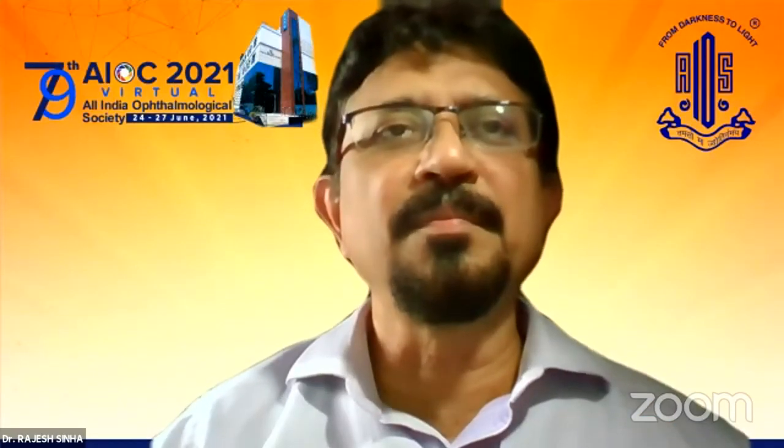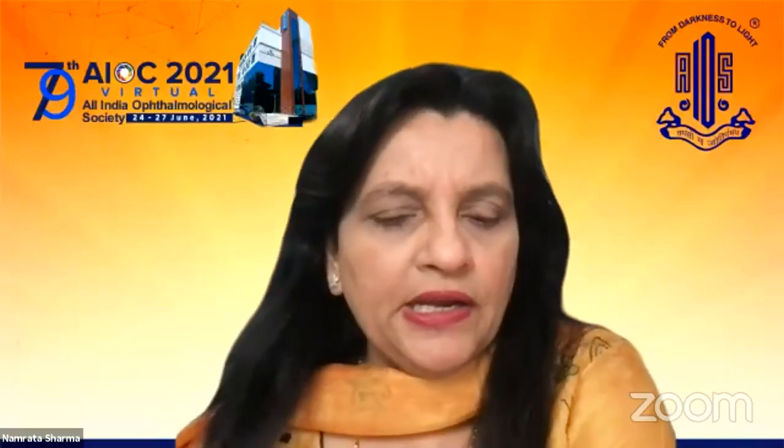Dr. Tratler wants to say something. Yeah, please. The Schwind one is only for PTK. You customize for PTK. The delivery system is a standard one only. The UV delivery system is standard only. The PTK part picks up from the topography map and we can have different shapes, oval, round, or whatever. Avedro, I think, had a program where selectively... that's a mosaic. They had the Avedro pixel mosaic. Somehow they did only trials in India. After that, they took their machines back and there is no machine available in India.